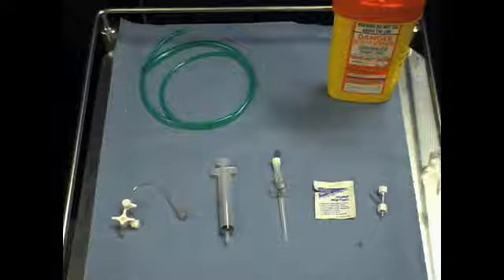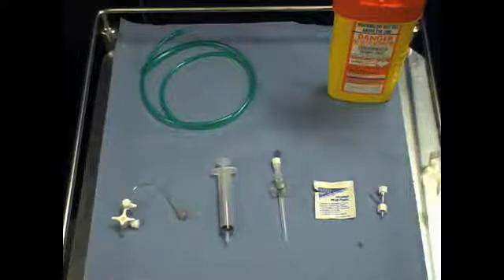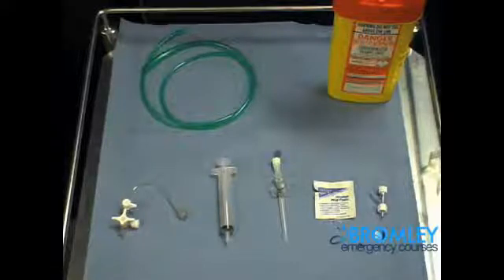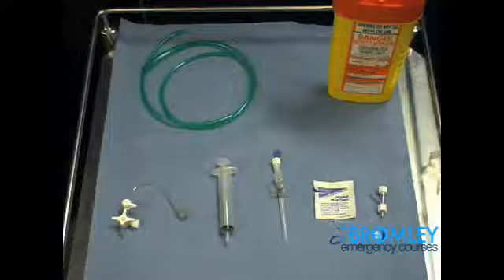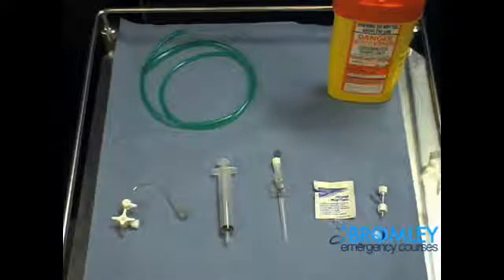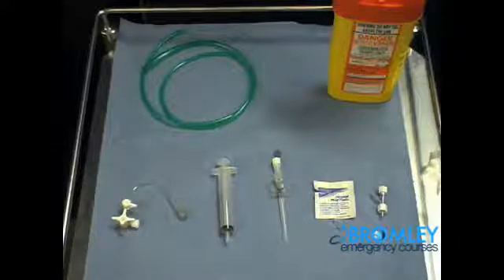This procedure video will take you through the technique of performing an emergency cricothyroidotomy in either an adult or paediatric patient.